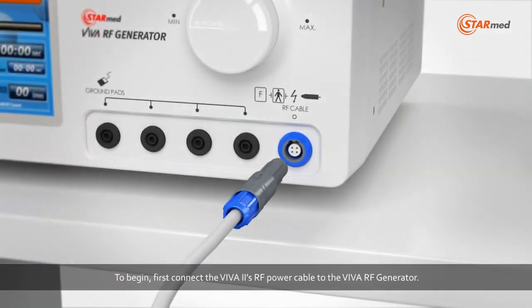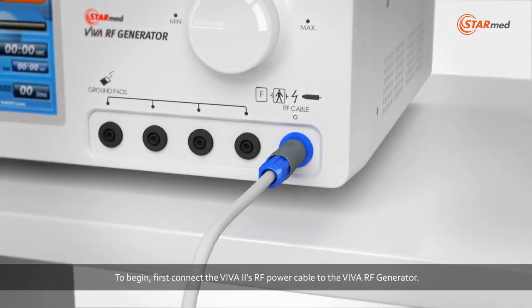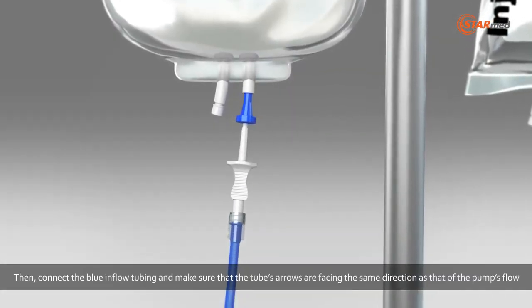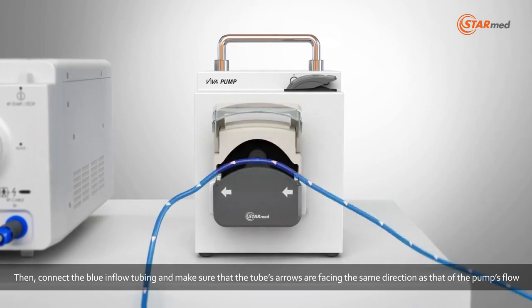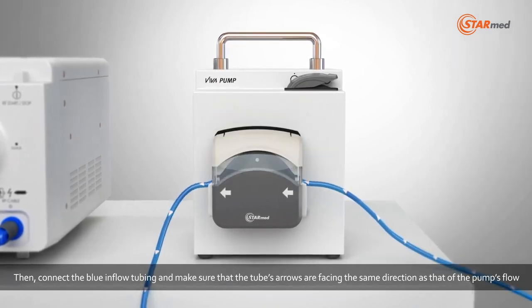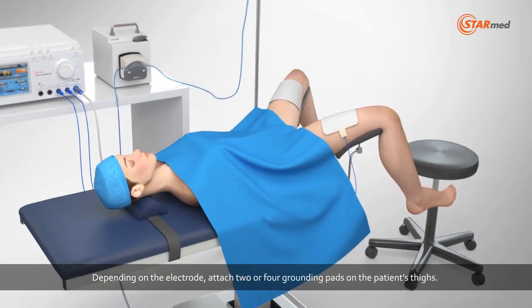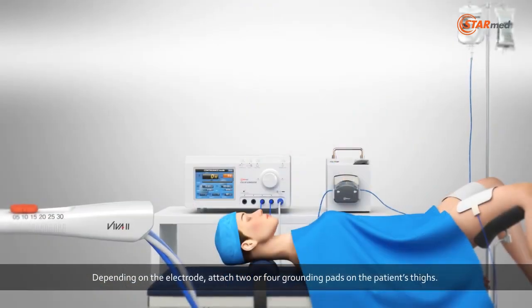To begin, first connect the Viva 2's RF power cable to the Viva RF generator. Then connect the blue inflow tubing and make sure that the tube's arrows are facing the same direction as that of the pump's flow. Depending on the electrode, attach two or four grounding pads on the patient's thighs.